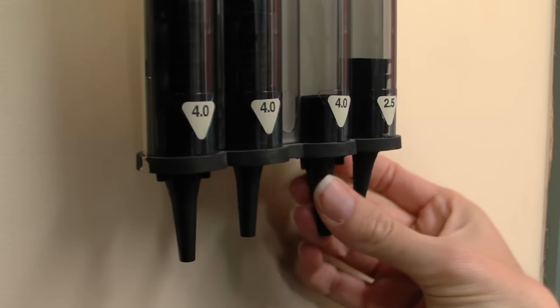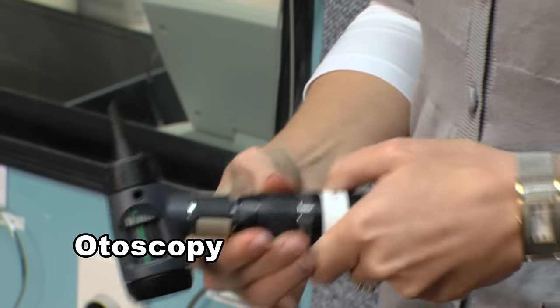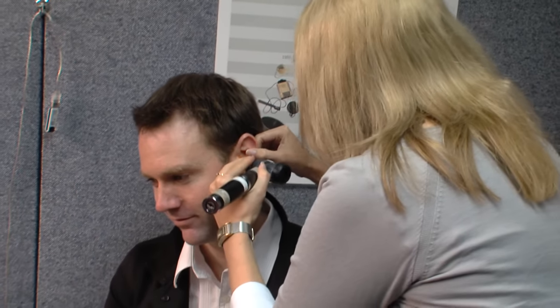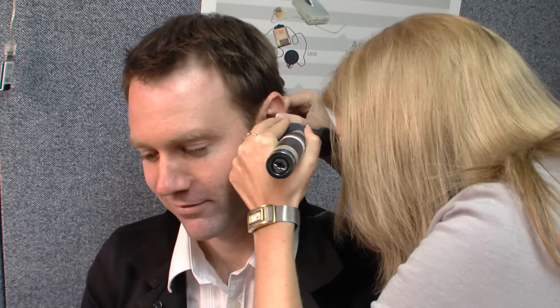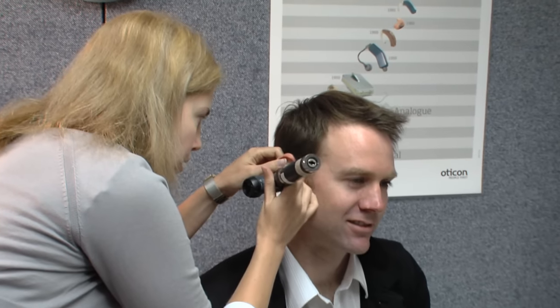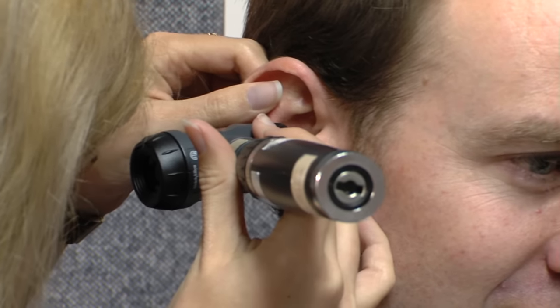So what we'll do is I'll just have a look in your ears for a start and then we'll get on with the hearing test. Important clues about some conditions that may affect hearing can be obtained through an otoscopic examination of the client's ear canals. Good, and we'll just check the other one. Otoscopy also establishes whether the patient's ear canals are sufficiently free of wax or other debris to proceed with testing.